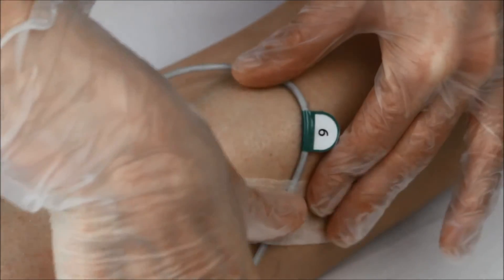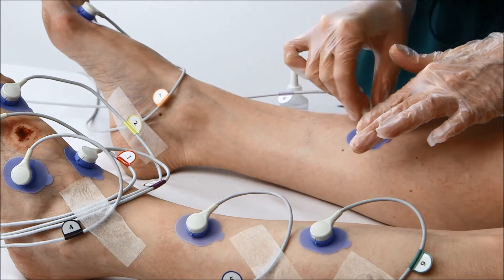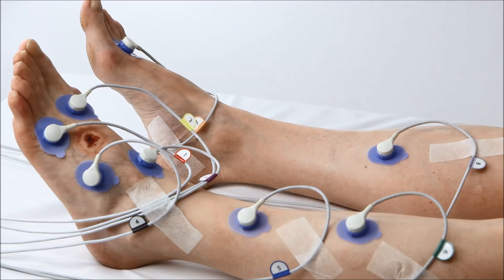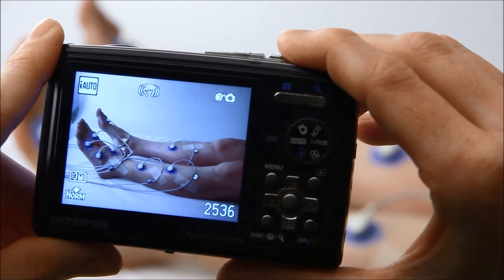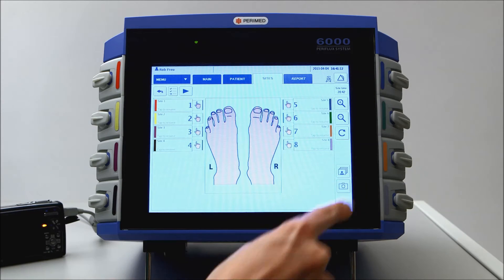Secure the cable with tape. For accurate data interpretation and follow-up measurements, it's important to document the electrode positions. Take a digital photo, connect the camera to the USB port, and tap the camera icon.